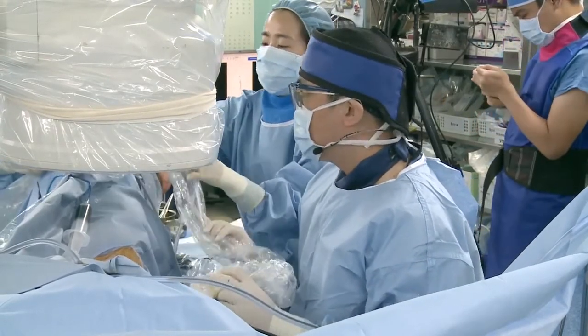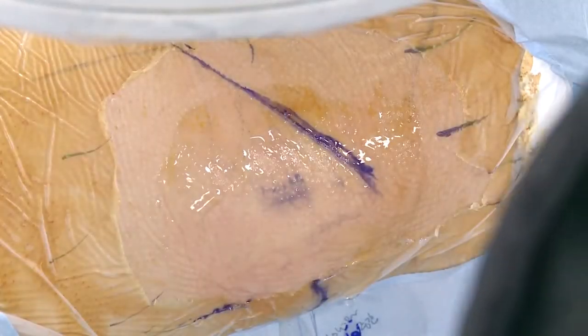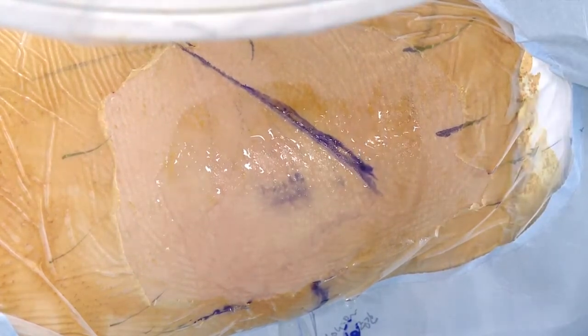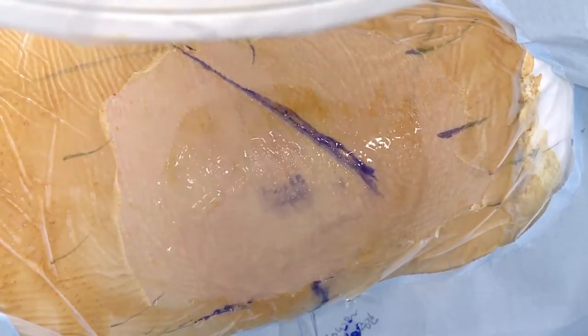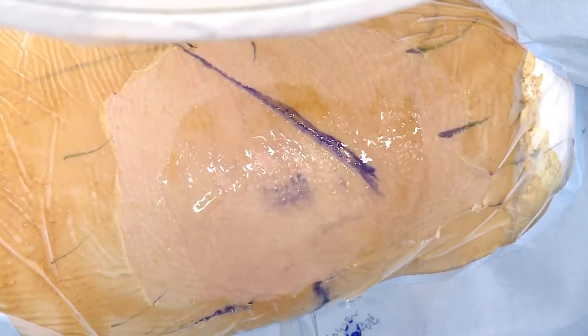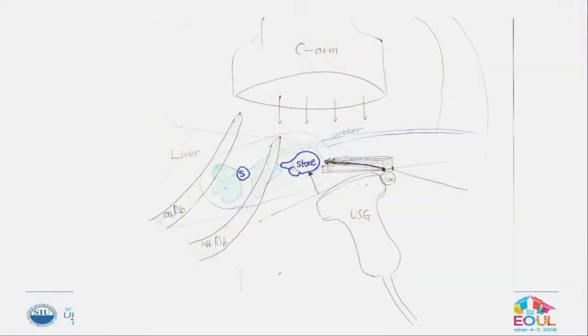So, can I start? So you're presenting here, so you're already in with the ureterorenoscope? Okay. Because this surgery has its issues, they already inserted the ureteral access sheath to the UPJ level, and I checked the renal pelvis. Okay. And this slide is about the patient's status, about the renal stone and kidney.